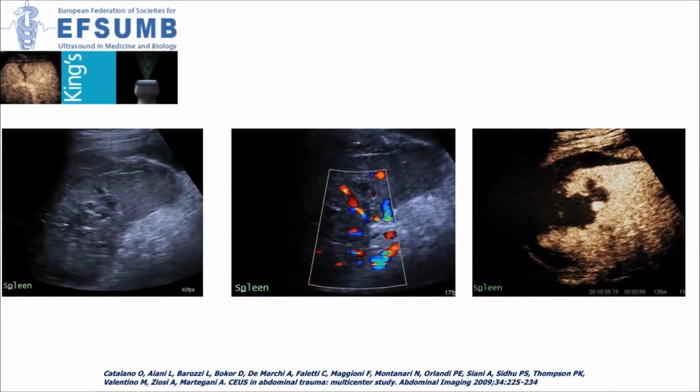And I think particularly in the pediatric population, this is very important because this is the group in which we want to avoid repeating CT. We want to avoid the equivocal finding. And in the spleen, we have that zebra stripe appearance, which can make identification very difficult.